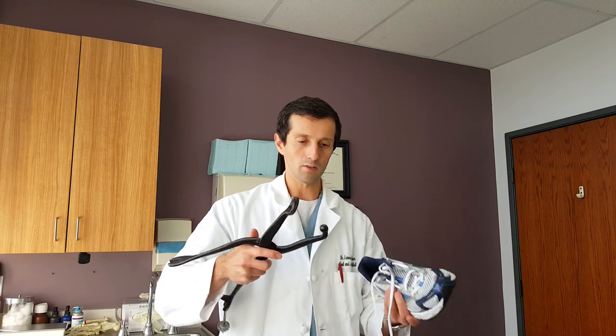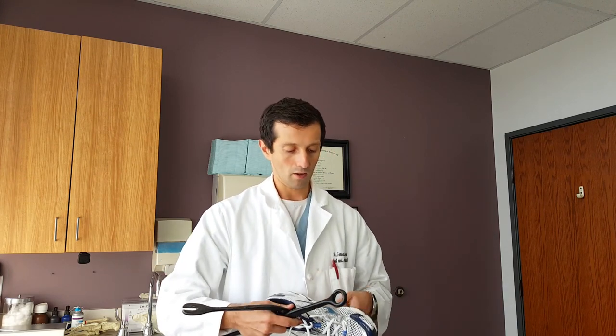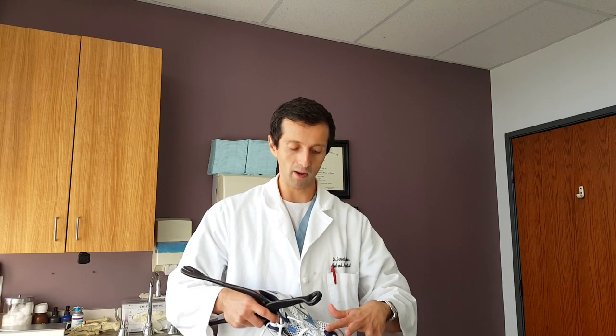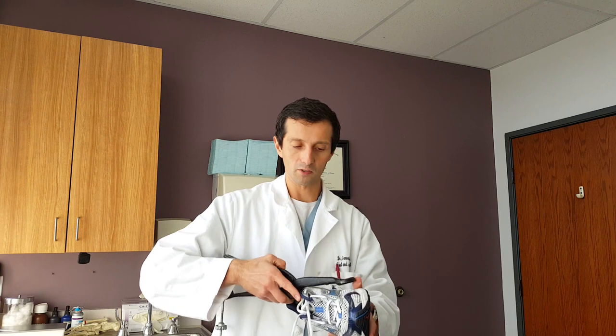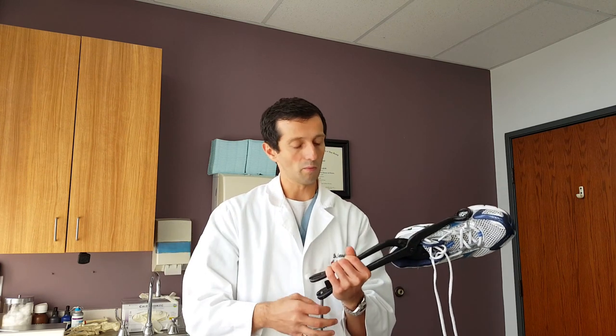Basically what you do is put the ball aspect inside the shoe. So let's say we're treating a bunion — you put your foot inside the shoe first, feel around where you have the most amount of pain, put a piece of tape over it so you know exactly what area to stretch. Then the ball part goes in first, the ring is on the outside, and you compress it down.